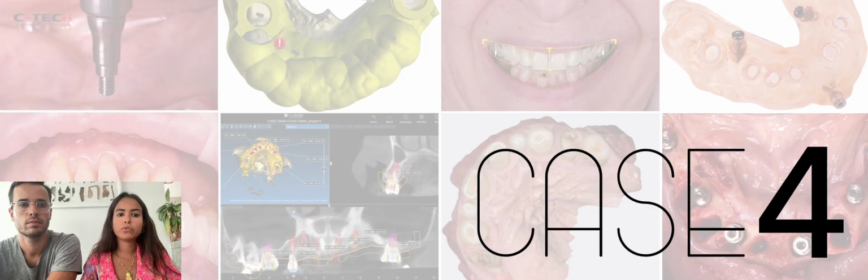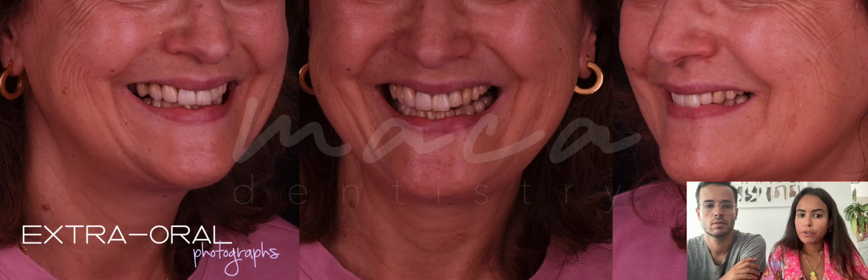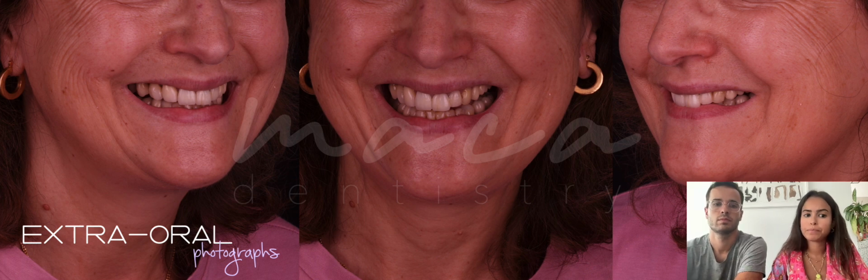And now let's jump to the last case of this lecture. These are the initial external photographs of the patient. The main reason that brought her to us was having several old treatments that were failing, and also the fact that she was not happy with the appearance of her smile. We can see that the smile is not harmonious and that she presents a big upper midline deviation.